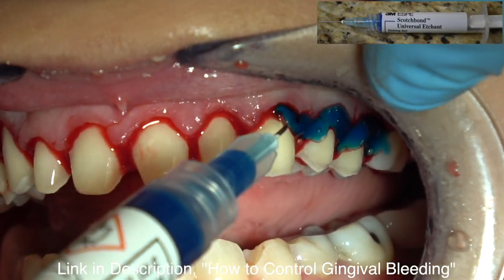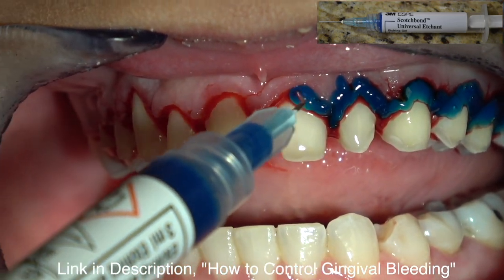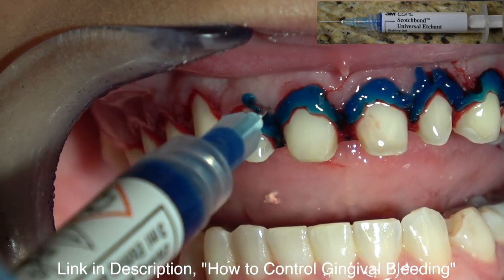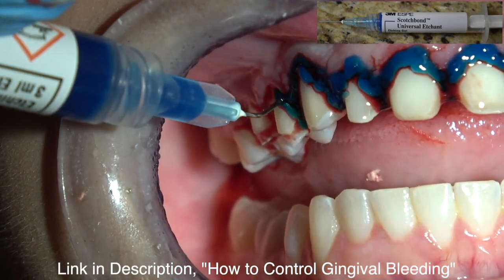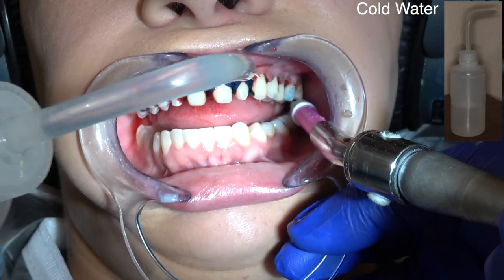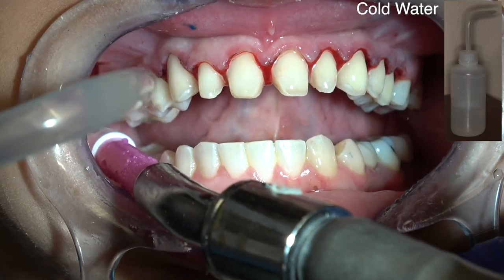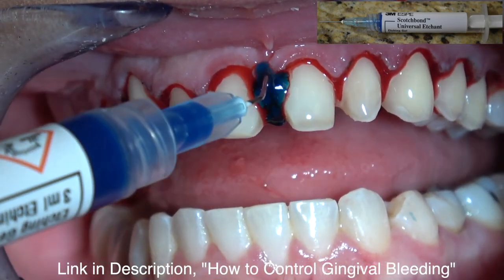Now I'm going to place 38% phosphoric acid, which is one of the best hemostatic agents I've found — and I discovered it by accident when I was seeding veneers one time. I'm going to leave this for 45 seconds, then I'm going to rinse it with ice cold water in a plastic water bottle. You don't want to rinse it with your air water syringe or you'll stir up the bleeding again.